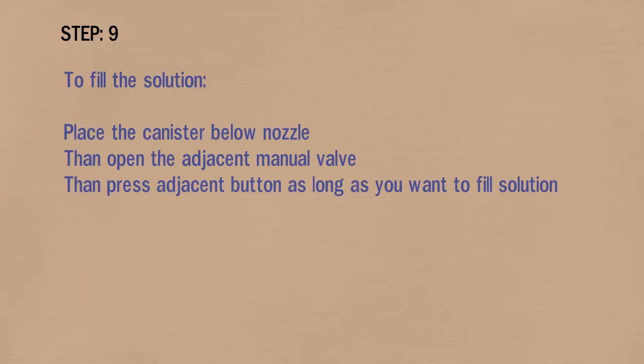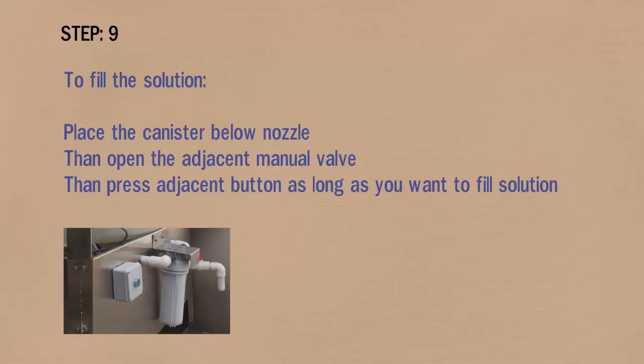In step 9, to fill the solution, place the canister below the nozzle, open the adjacent manual valve, and then press the adjacent button for as long as you want to fill the solution.